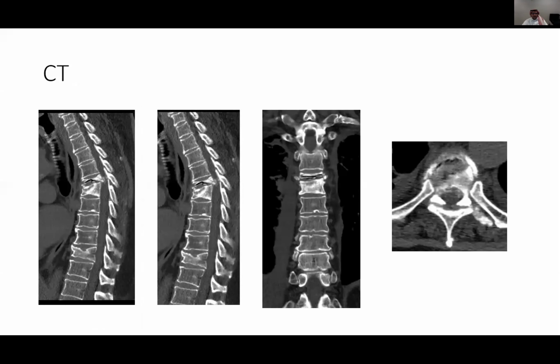If you can see, I think it's actually two fractures. One is above, which is almost vertebra plana, and the other is only the upper part of the plate. So what I will do is a classical long posterior fixation. We try for correction and decompression, which is important to relieve the cord. If the patient improves, I may also do vertebral replacement if it is possible and the osteoporosis improves, which is another excessive operation that I will not recommend if the first one is going nicely.